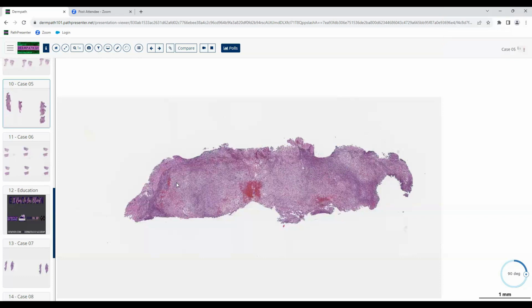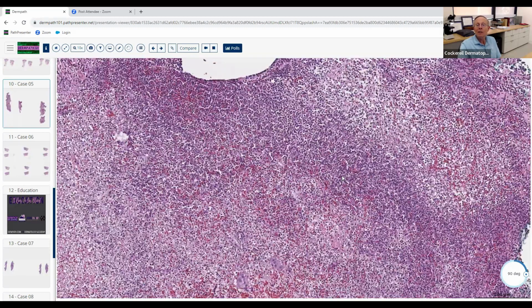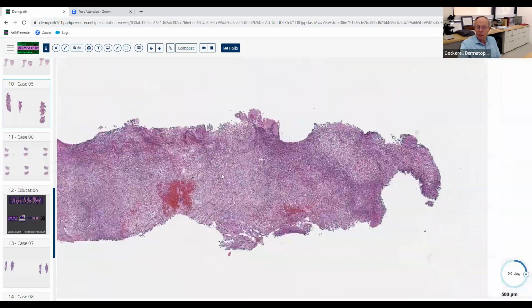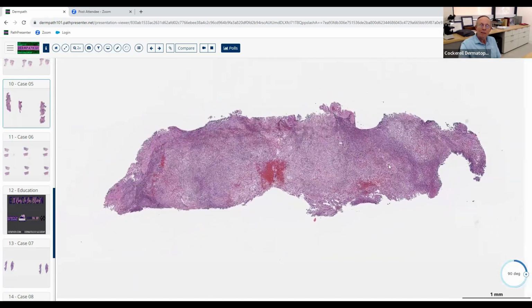So when you see something like this, well, they're not dark enough for lymphocytes. They're not quite light enough for histiocytes. They probably then are going to be neutrophils. So it's almost kind of a diagnosis of exclusion. So if this is a sea of neutrophils, on higher magnification, see, we're right. They are neutrophils here. That gives us a differential diagnosis also. And it's also not gargantuan. So what diseases cause a dense diffuse infiltrate of mostly neutrophils?